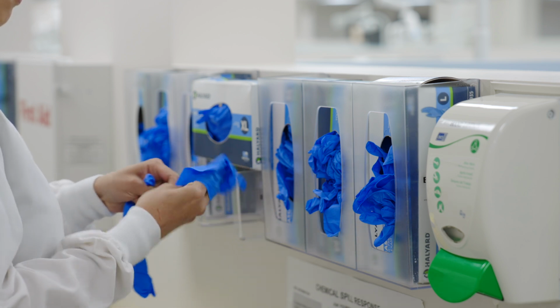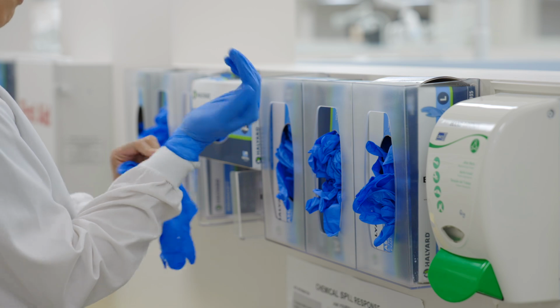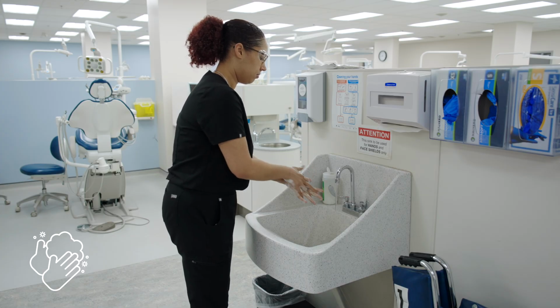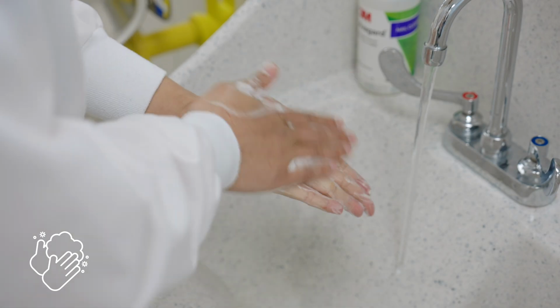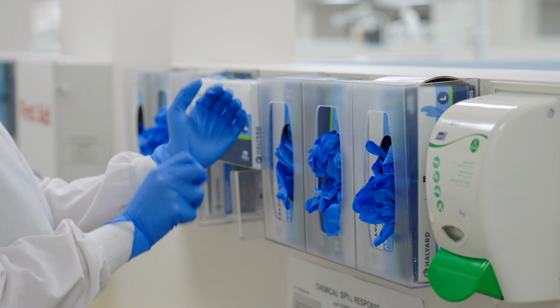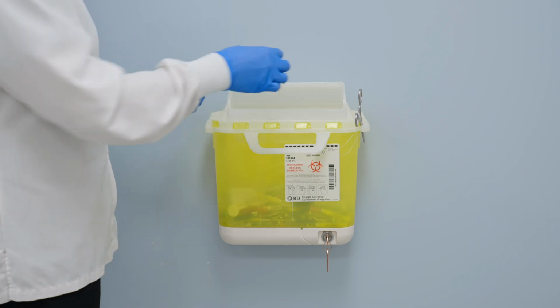Once patient treatment is finished, doff gloves and your clinic jacket and perform hand hygiene. Walk the patient out to the waiting area. Upon returning to the cubicle, perform hand hygiene and don clean clinic jacket or disposable yellow gown. Carefully remove any blades and disposable sharps and place in the nearest sharps container.